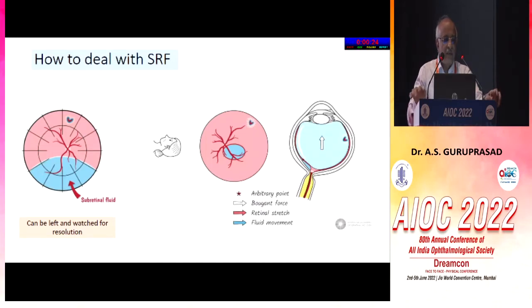Dealing with SRF, if it is something like the picture on the left, I think you need not really bother, it can be left and watched for resolution. But if it is at the macula, then you have to probably inject gas and wait for it to get displaced from there.